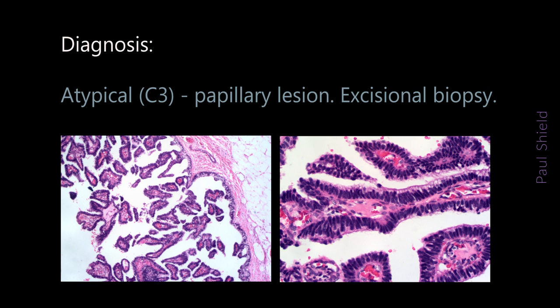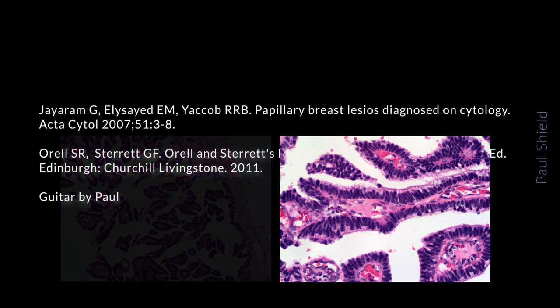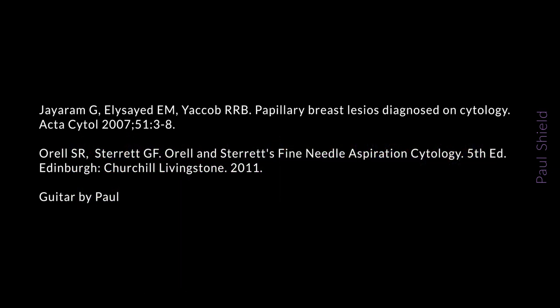Finally, it's important not to overinterpret pseudopapillary arrangements. These can be seen in fibroadenoma, and also sometimes you can get conditions where you get a perithelioma arrangement. For example, granulation tissue can do that sometimes with histiocytes, and also malignant melanoma can produce that pattern as well, which can mimic a papillary arrangement with a fibrovascular core.